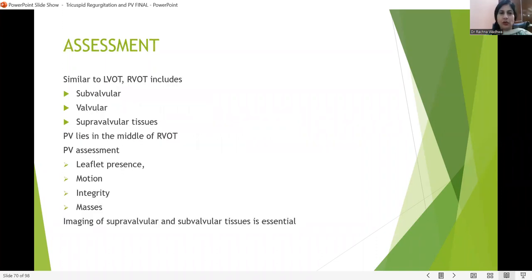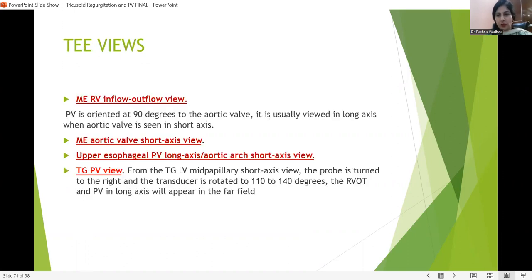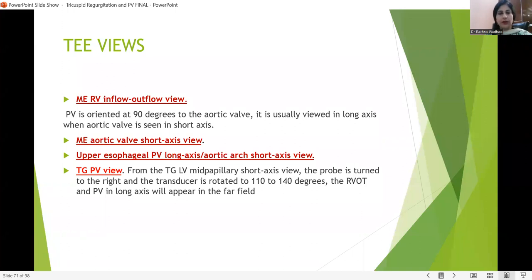Similar to the LVOT, the RVOT also includes subvalvular, valvular, and supravalvular tissues, with the pulmonary valve lying in the middle. Pulmonary valve assessment includes: how many leaflets, their motion and integrity, any mass, and RVOT obstruction. The different views are: mid-esophageal RV inflow-outflow view (most commonly used, where pulmonary valve is oriented at 90 degrees, obtained by rotating to 30–60 degrees from aortic valve short axis); the upper esophageal pulmonary valve long axis or aortic short axis view (good for PDA and gradient measurement); and the transgastric pulmonary valve view (probe turned right, transducer rotated 110–140 degrees, showing RVOT and pulmonary valve in long axis).